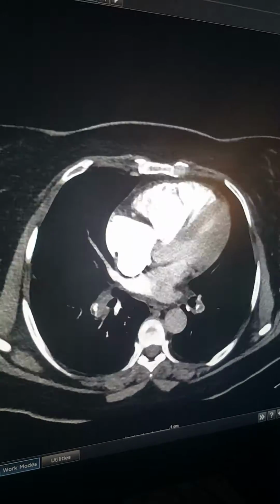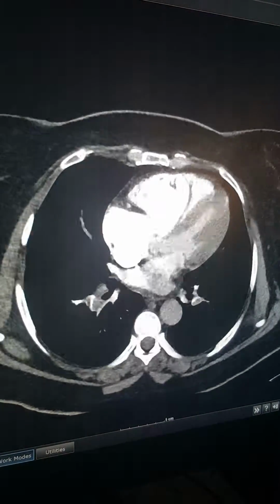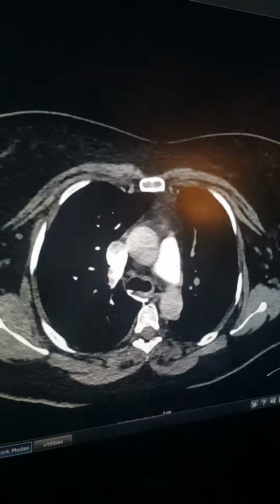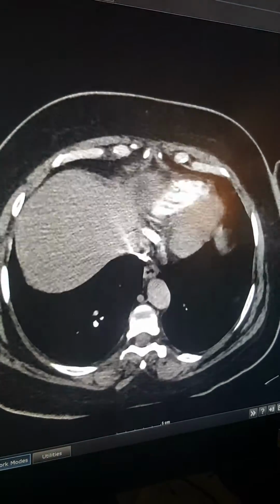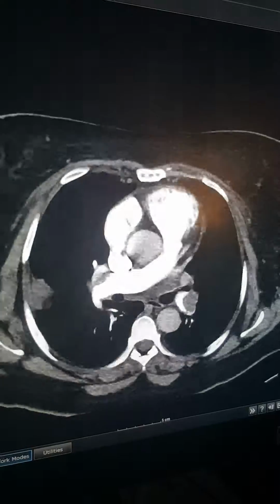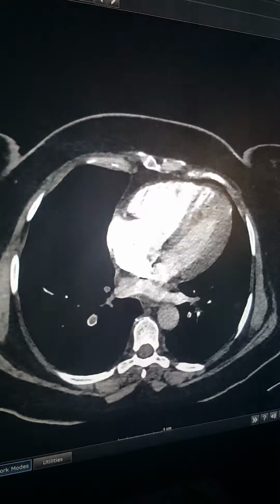Excellent. But the clinical diagnosis from our standpoint is massive pulmonary embolism if there is hemodynamic compromise, i.e. hypotension. Absolutely. That's from a clinical point of view, but from a radiological point of view, as you know, we don't know what is happening with the patient.